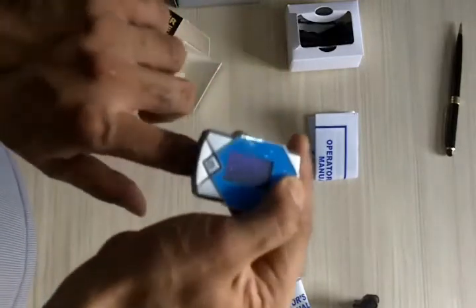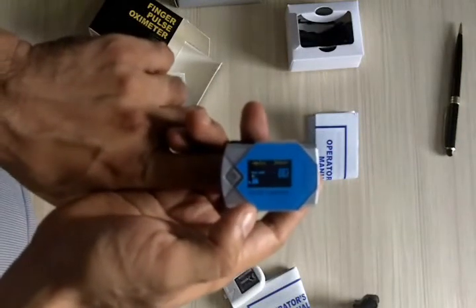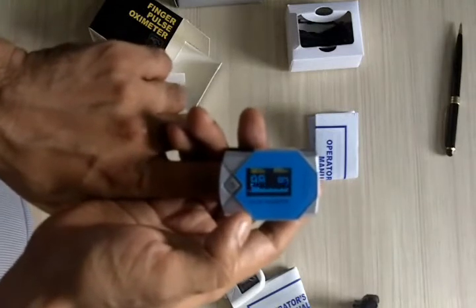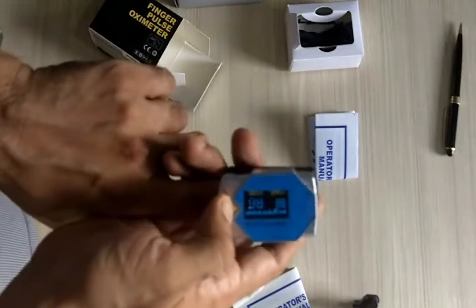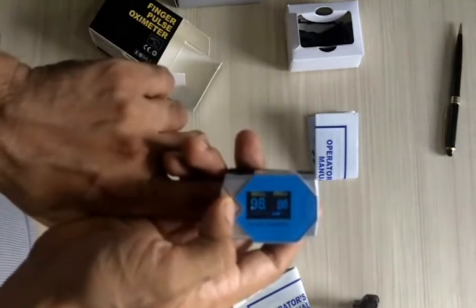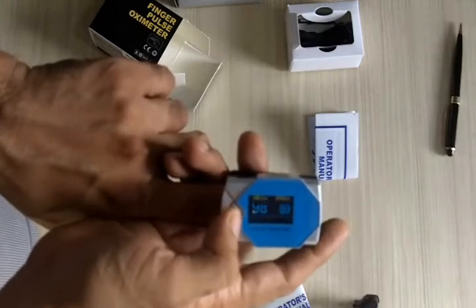Push your finger all the way in, press the button, and the system will start functioning almost immediately. You'll be able to get the SpO2 reading as well as the pulse waveform. You can press the button and get the audio alarm feature activated.